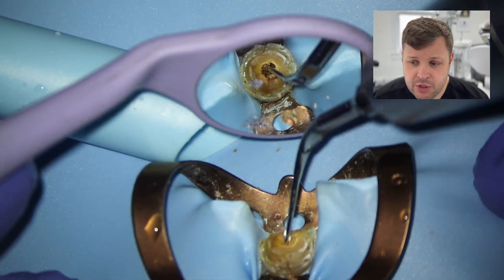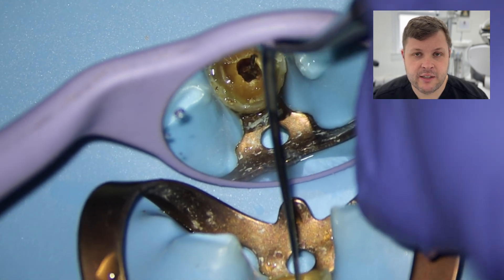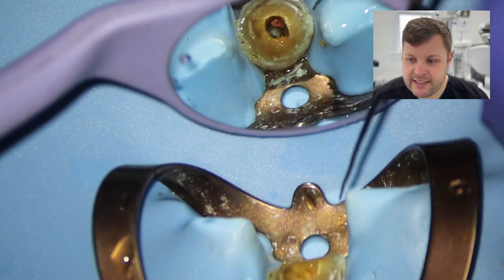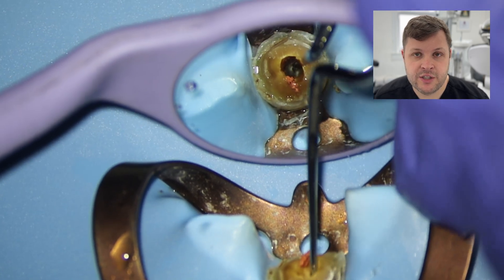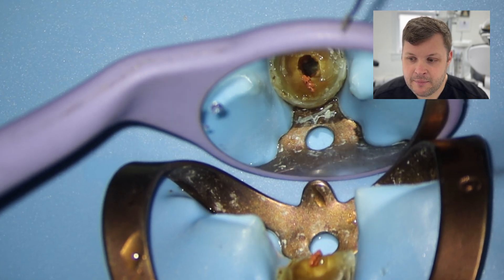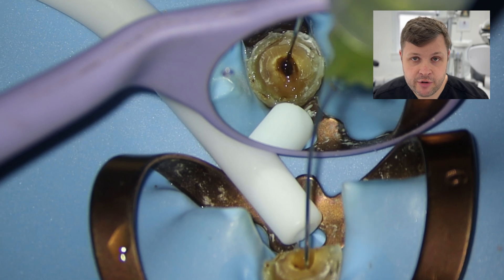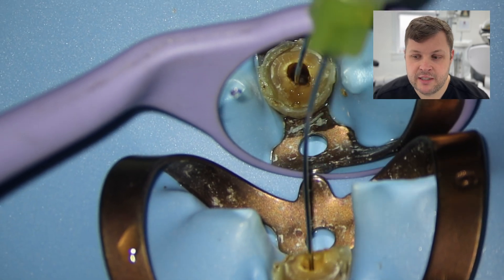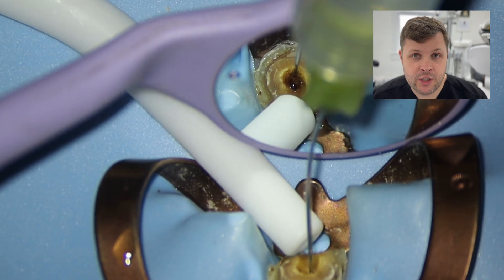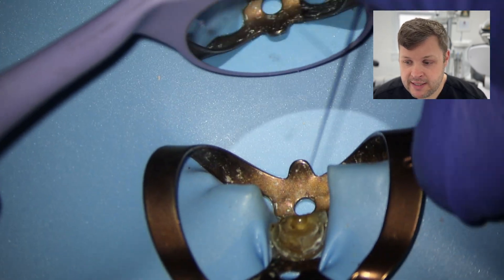There are fragments of GP remaining, so I'm using the high-energy ultrasonic to give it a good clean out. I've also got a GP removal instrument — like a very long DG probe, maybe twice as long, with a tiny hook on the end — and I'm just pulling out these tiny fragments. Lots of patience, no rush, take your time. I prefer stainless steel irrigation needles rather than the Irriflex during re-root treatment as they've got more strength. Once all the GP is out, I'll swap over to the more flexible Irriflex tip.